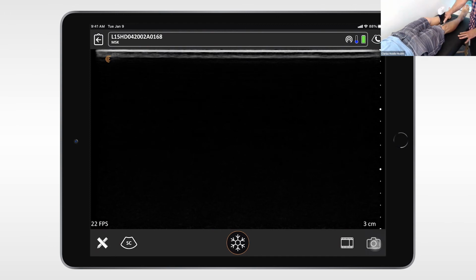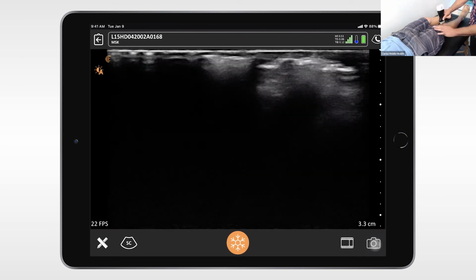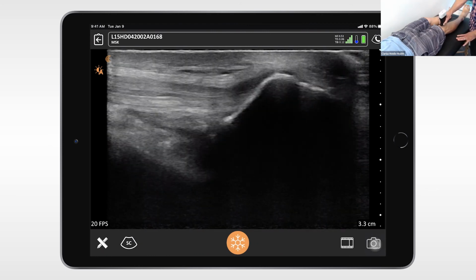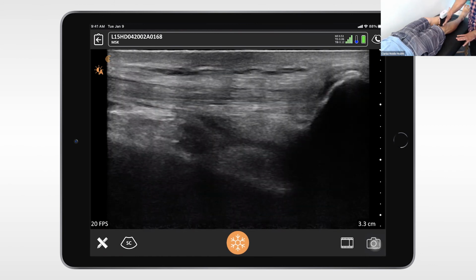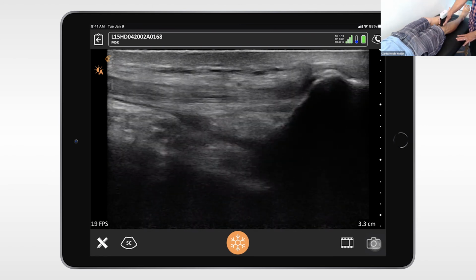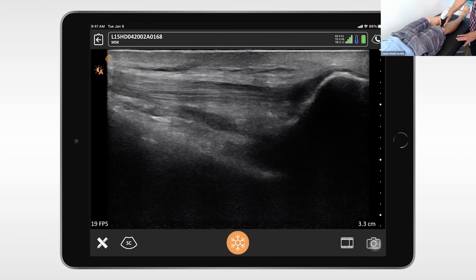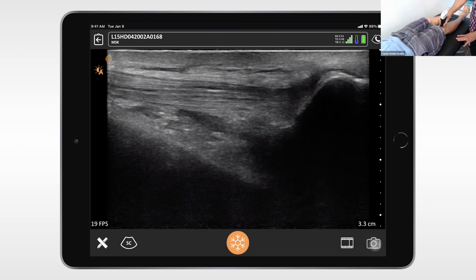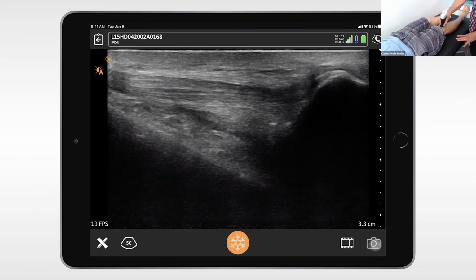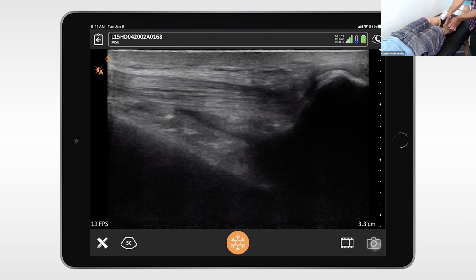Usually I start in the suprapatellar region when I'm doing a full knee scan. Is this where you start also for your knee scans? Yeah, you can start indeed in this suprapatellar region. You're doing this correctly with the patella on the right side of the screen, and attached to the patella we can see the quadriceps tendon, also the layers of the quadriceps tendon. The image quality is absolutely magnificent, and we can see underneath the quadriceps tendon the suprapatellar recess, a little bit filled with fluid right here. This is definitely interesting to spot to start your assessment of the knee joint.